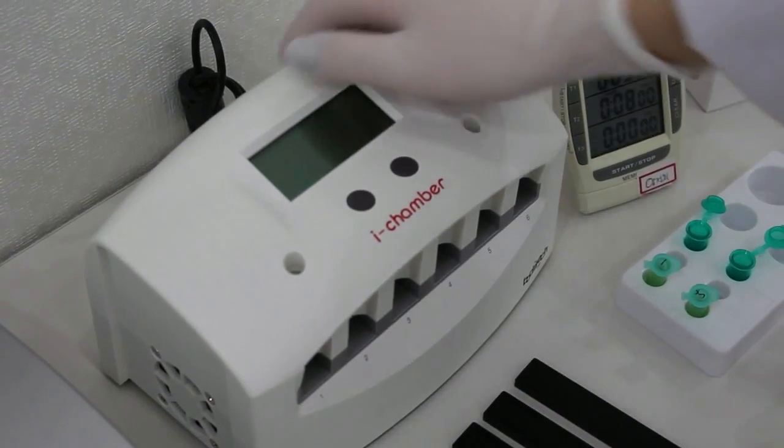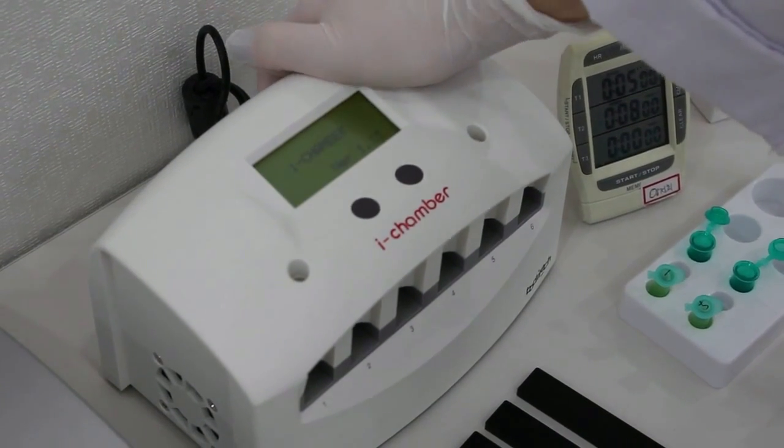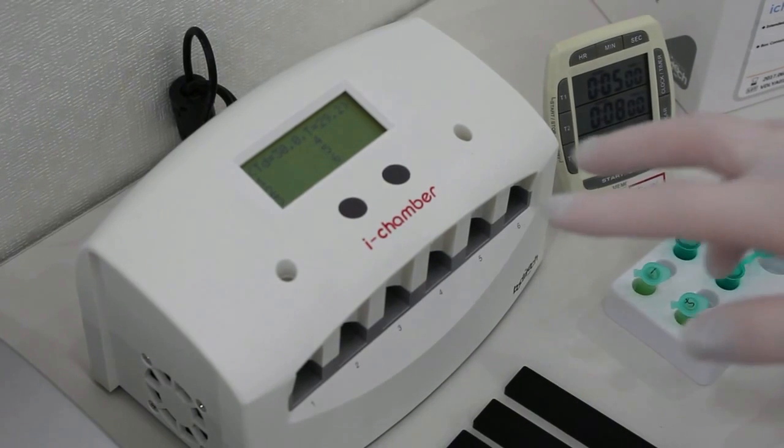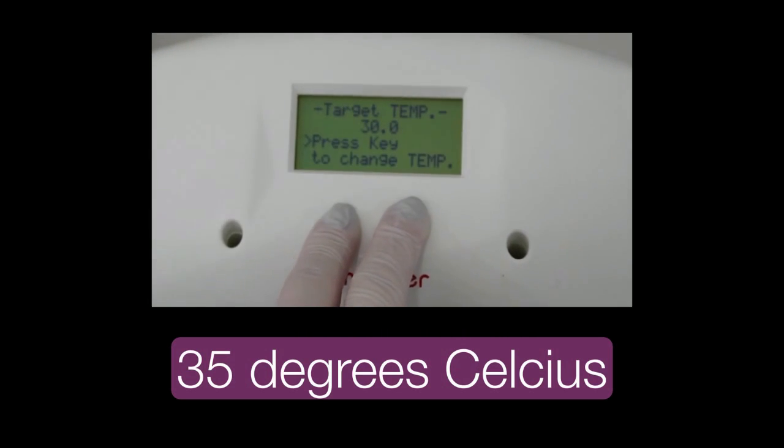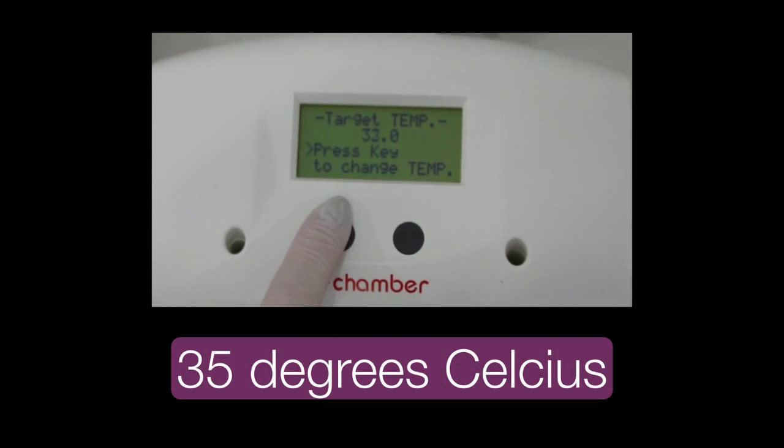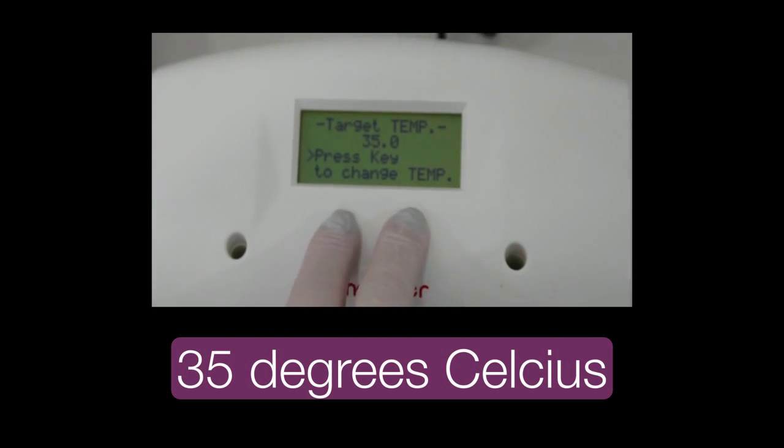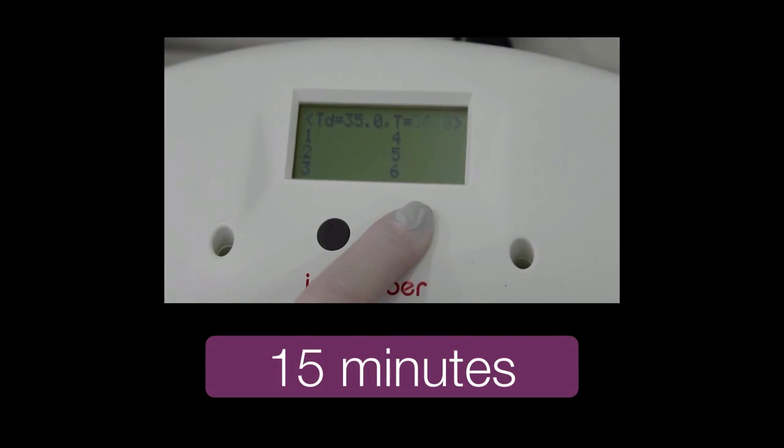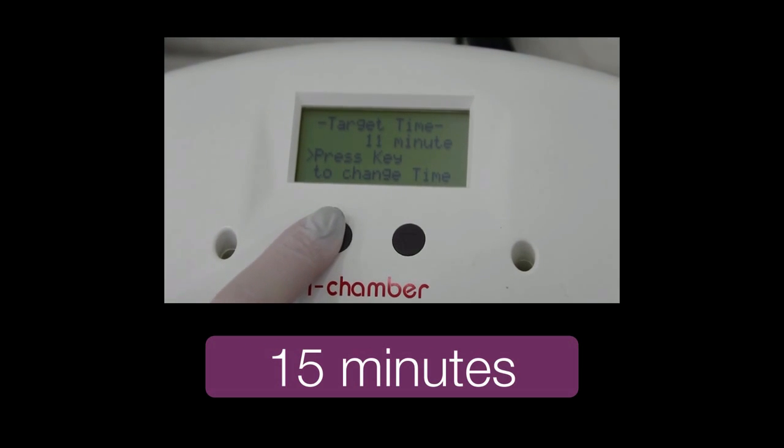Turn on the iChamber and set the temperature to 35 degrees Celsius. To do so, simultaneously press the two buttons on the front of the machine for 5 seconds and adjust accordingly. Simultaneously quick press both buttons to go back to the main screen. Then set the time to 15 minutes. Long press the right button and adjust the time accordingly.